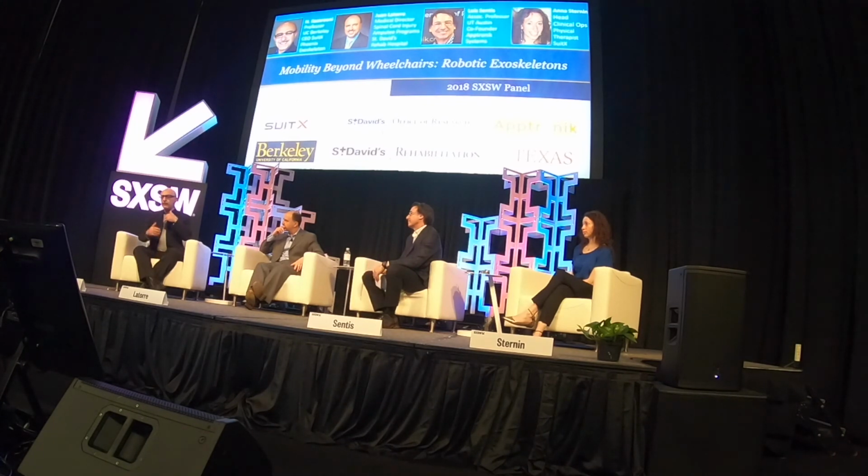In the future there will be many ways of doing that, and we try to separate that from the machine itself. So the machine stands here, but the human-machine interface can be changed, and depending on the person, they can choose a variety of them. Right now, we have the simplest form. Also, there's a huge difference between technology and a product. A product can be sold. It has to be functional for the user, absolutely work, do the job. Technology is something that represents what we can do as humans, and there is a huge difference between them, and it takes a long time to move from technology to an actual product.